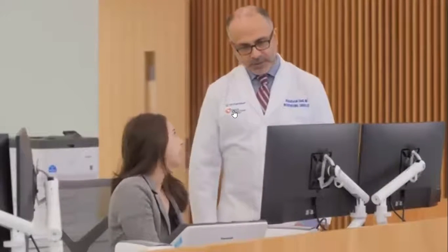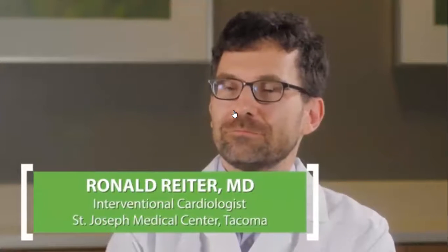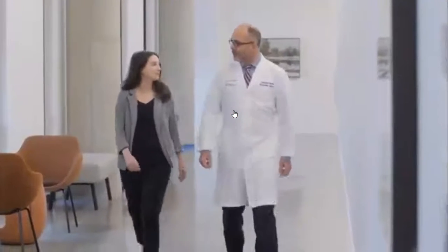Transcatheter aortic valve replacement, or TAVR, is a minimally invasive heart procedure aiming to replace the narrowed and diseased aortic valve without the need for open heart surgery. You would be a candidate for TAVR if you have severe aortic stenosis, which is clinical speak for severe narrowing of your aortic valve. Generally speaking, they have symptoms as well: shortness of breath, chest pain or chest pressure, dizziness, fainting, or all kinds of classic symptoms. They used to be able to walk to their mailbox and back, and now it makes them so short of breath they need to stop and rest, or their energy level has really decreased. They're not able to have the quality of life that they thought they should be having at this age, or they have definitely noticed that it has decreased over 6 months to a year, sometimes longer.